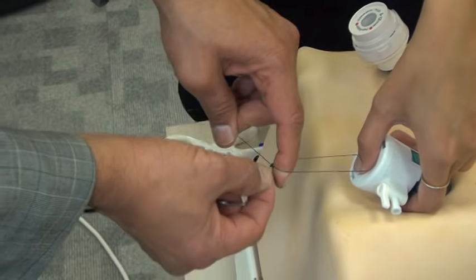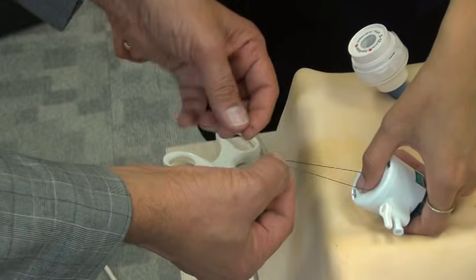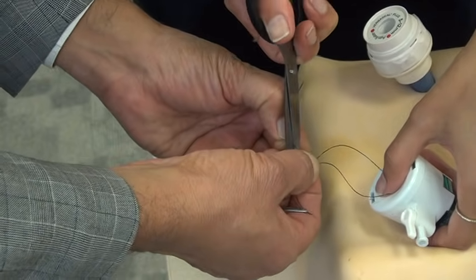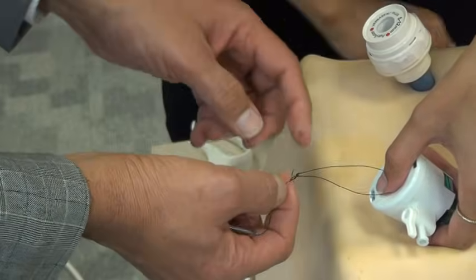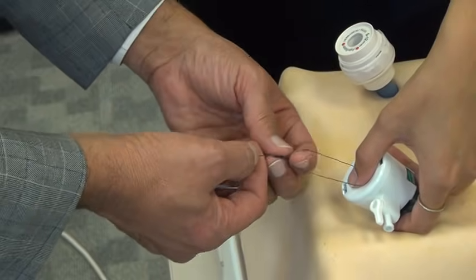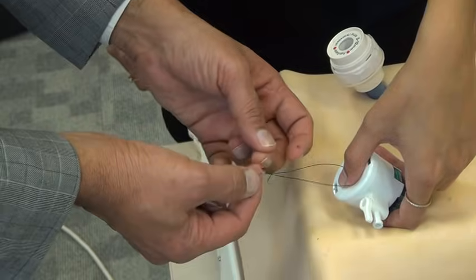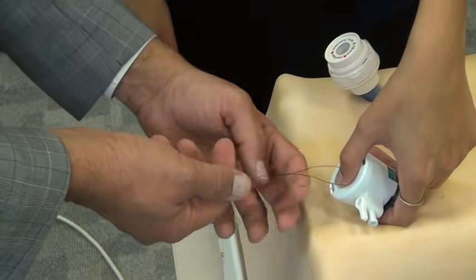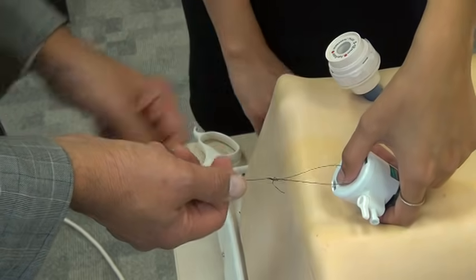Tighten the knot. Cut the tail to just about half an inch or an inch, so that you know this is your tail and the two ends don't get mixed up. You're still keeping the two limbs separate.